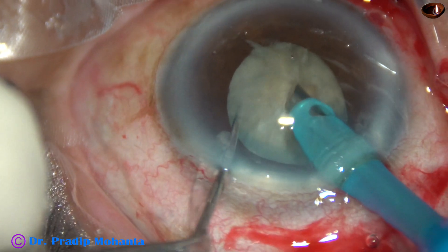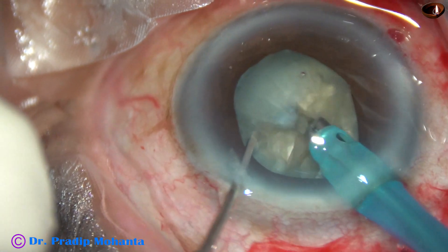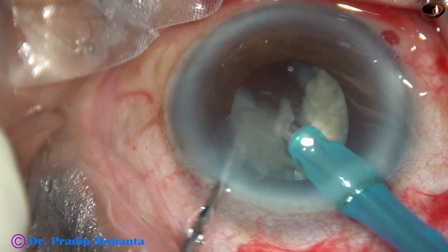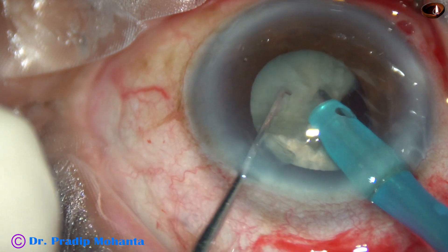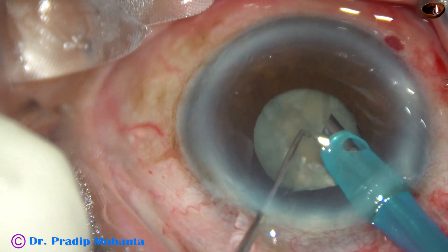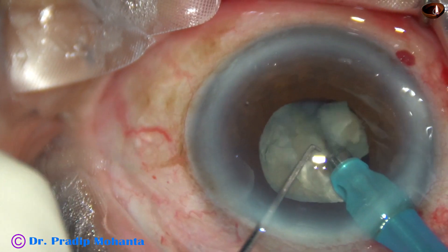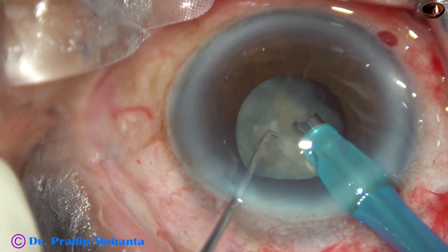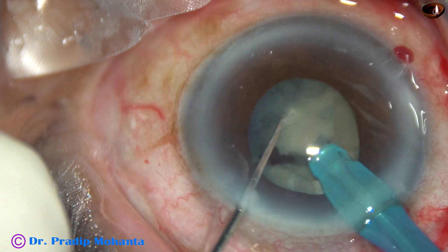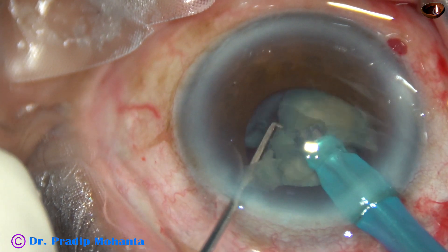The nucleus has been chopped very nicely. One hemi-nucleus has been divided into two large fragments. Now each large fragment is being emulsified. This is the other fragment — I am dividing it into two smaller pieces. At this time, you may notice that the pupil has started becoming small. However, it is not very small; the size at this time is about 4.5 mm. And I can complete nucleus management if the size of the pupil remains like this. Yes, this large fragment has been eaten up.